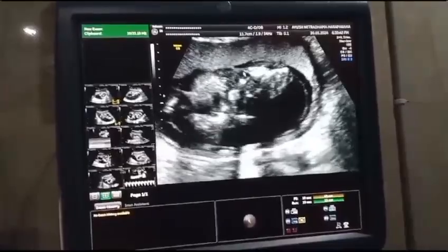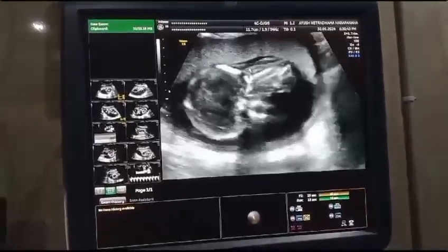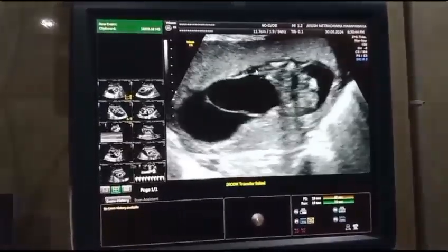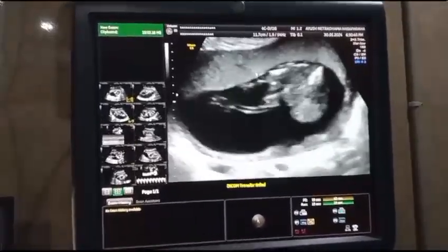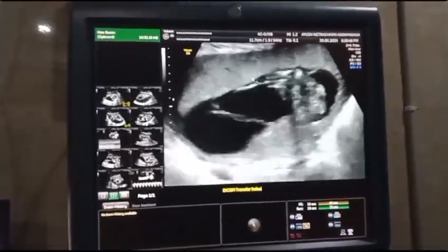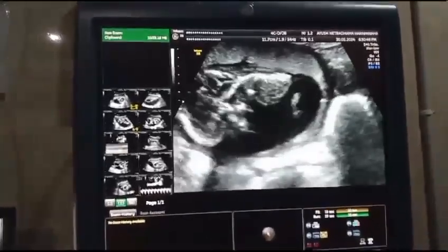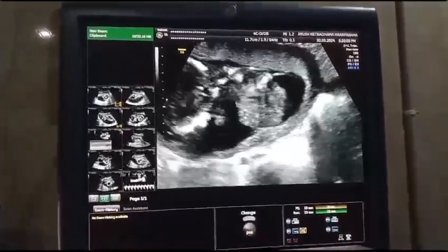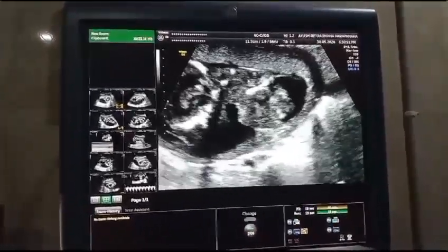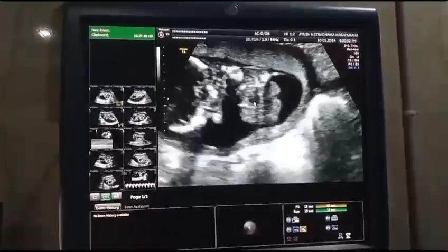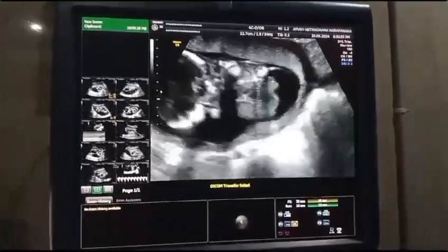This is called complex body wall and limb deformity — limb body wall complex anomalies. We see a very rare entity of ectopia cordis, where the heart is outside the fetal thoracic cavity.